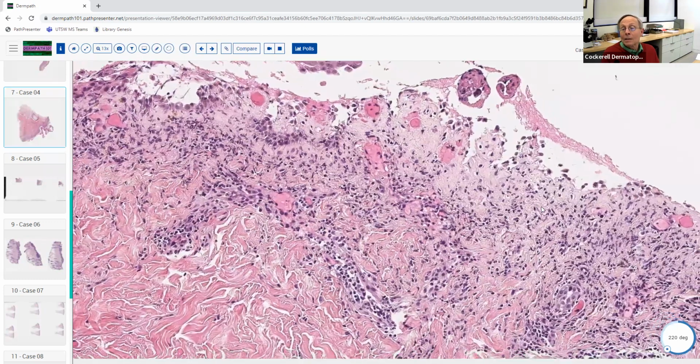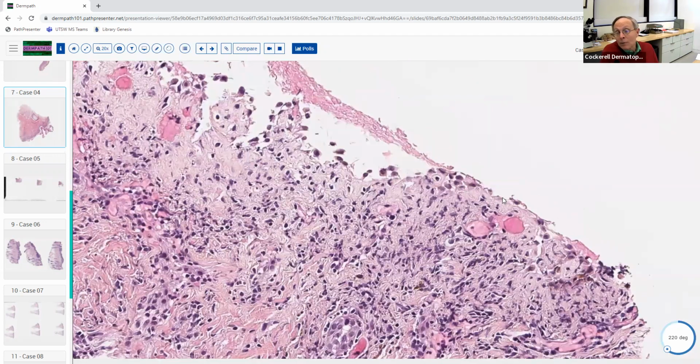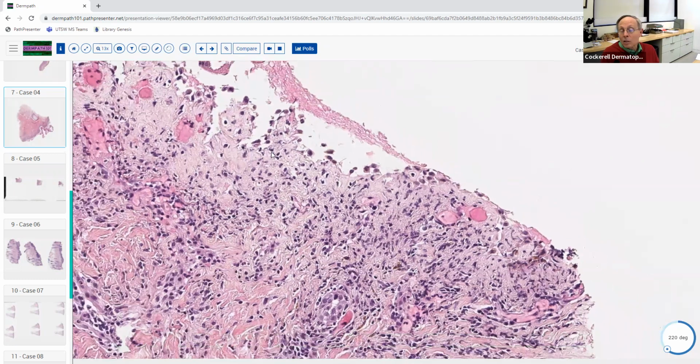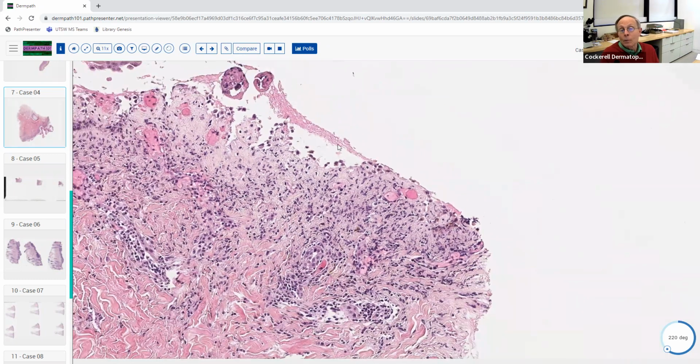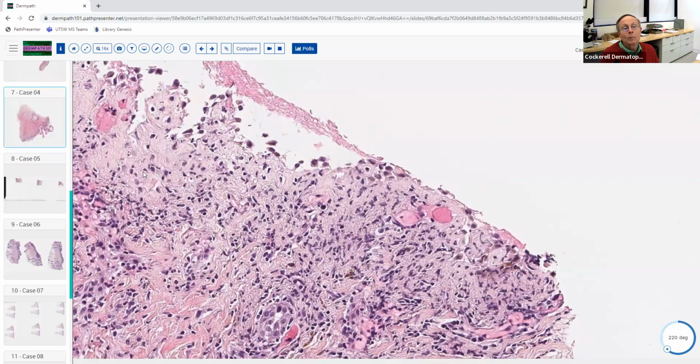Here, if you just have something like this, you might say it might even be subepidermal, because there's very few cells left over here. So you can see sometimes this isn't so easy for us when we get a biopsy. If we just had something that just showed this, we'd have a hard time calling that Pemphigus vulgaris. I mean, it almost looks like a subepidermal blister.